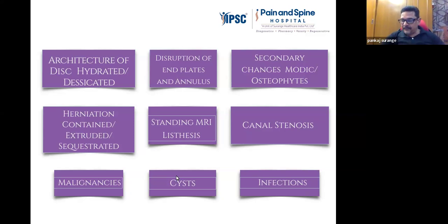Even if you do not have any suspicion of anything, at times we have to rule out infection. Before doing any intervention, we have to rule out infection. Especially what we commonly see is that a patient comes with sacroiliitis, clinical diagnosis, absolutely yes, clinically the patient is having sacroiliitis, but still before intervention, we must take an MRI to rule out an infective cause.